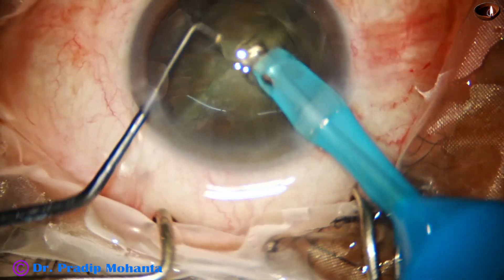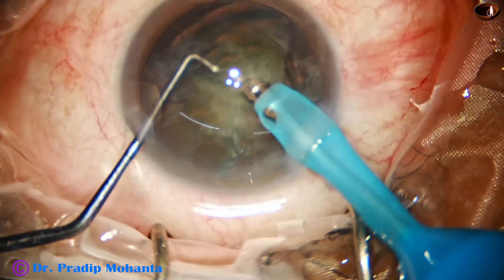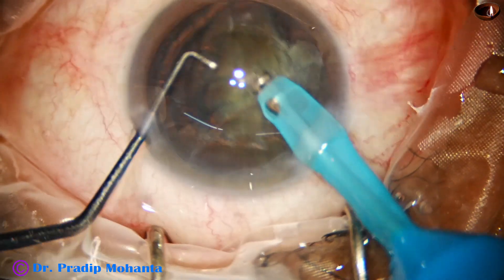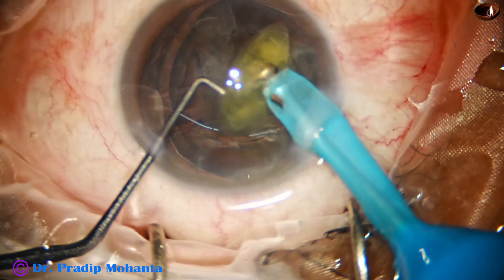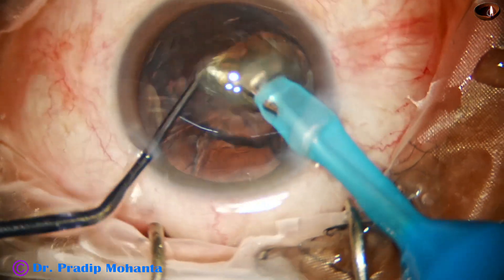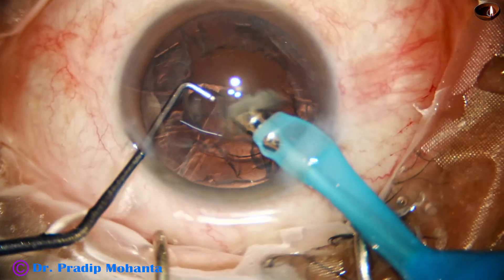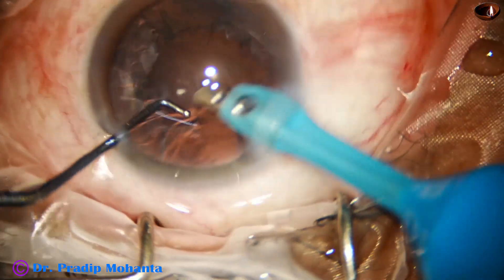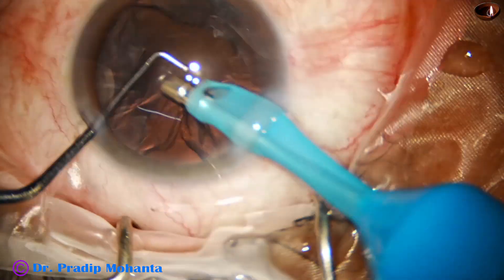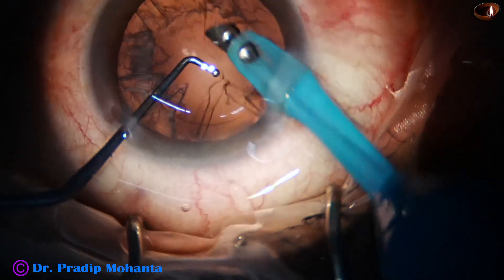Now we go with the phaco needle and pick up the pieces — the free nuclear fragments. It is extremely easy to pick up these pieces. We just have to separate the pieces and place the phaco needle at the apex of the pieces and they come easily. We bring the pieces to the center of the anterior chamber and emulsify them.